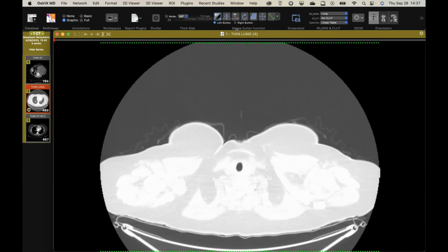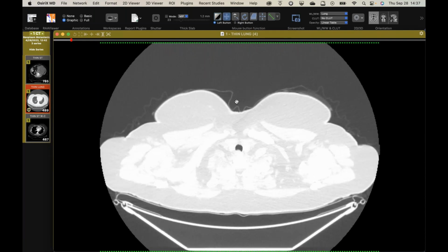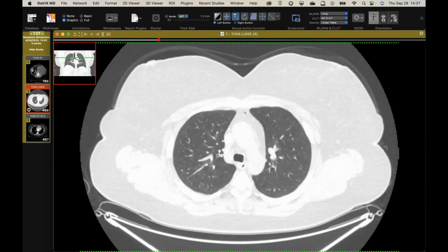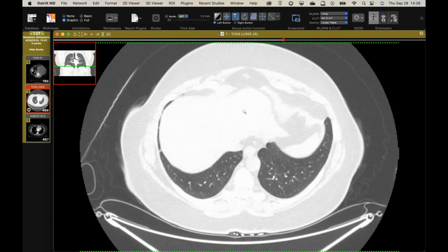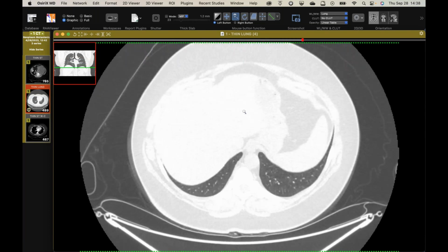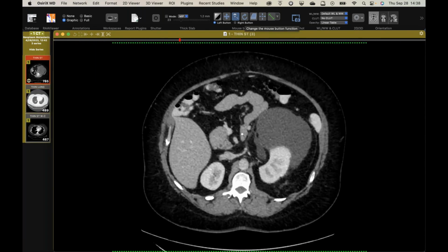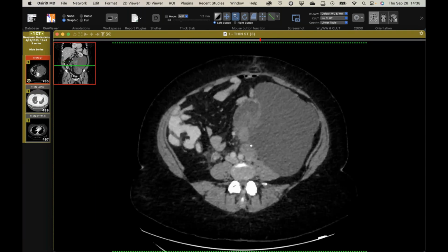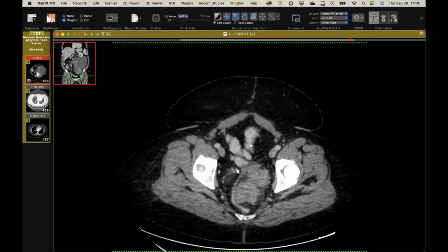So the imaging itself isn't interesting, but the pathology is quite. Unfortunately, I don't have the pathology. We won't get it because there's already a diagnosis. But this lady has a bunch of lung nodules, and they look like mets, right? They're just some solid ones, just hanging out everywhere. And what's interesting is if you look in her abdomen, she's got this large cystic thing, but then she's got all this soft tissue here. So, I mean, this looks ugly. You'd think some kind of sarcoma or something, or metastatic something.